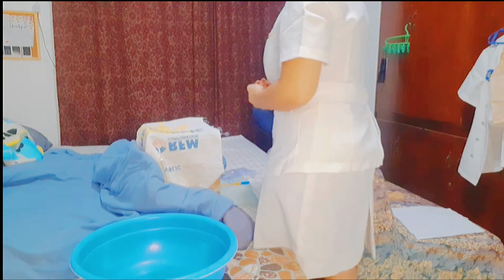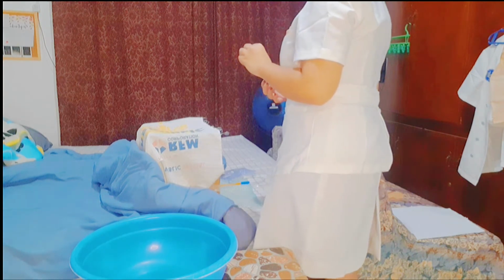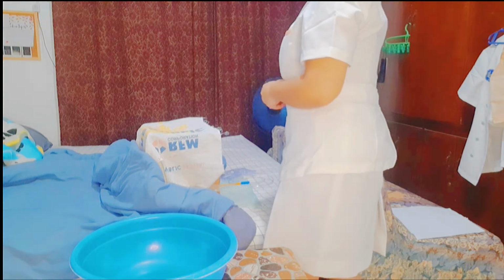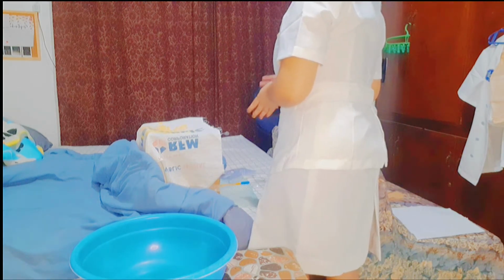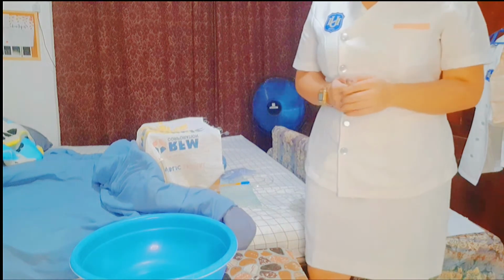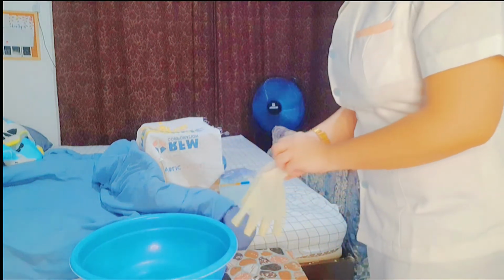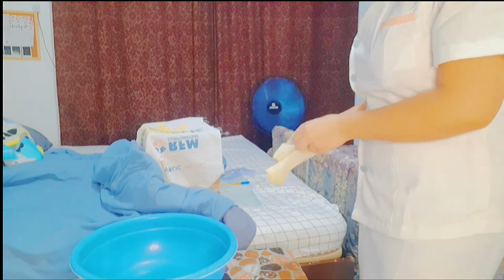So, ma'am, I will be cleaning your perineal area in order to prevent the spreading of microorganisms within the area or within the catheter. Then, after that, of course, you need to put on the clean gloves before cleaning the perineal area of the patient.